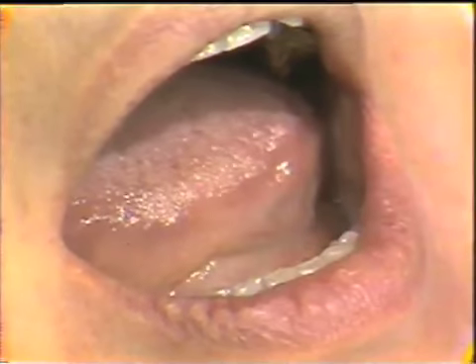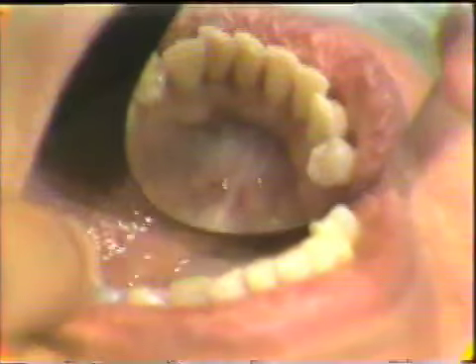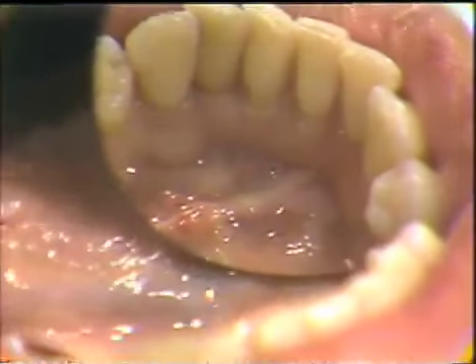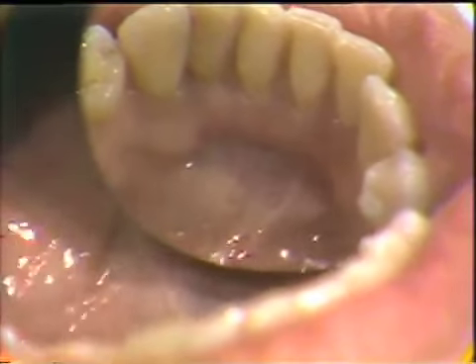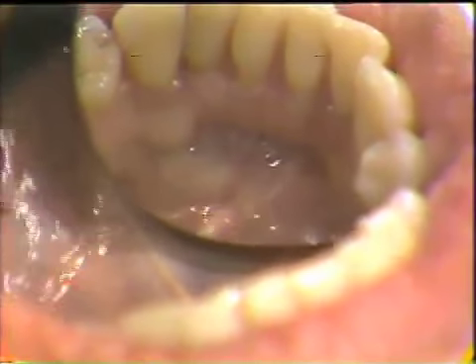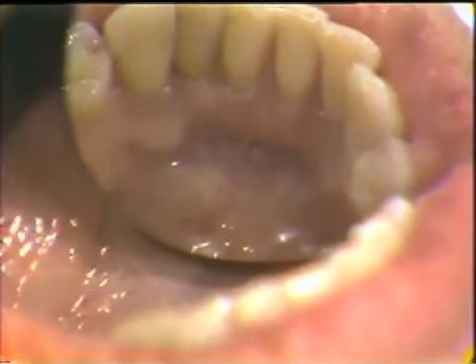Another thing that we look at in the examination of the tongue, as I said, was the mobility of the tongue. And I'm going to insert the mirror, and we'll have the patient make excursions with the tongue to the right and left, and observe the floor of the mouth and the attachment of the lingual frenum to the alveolar crest.